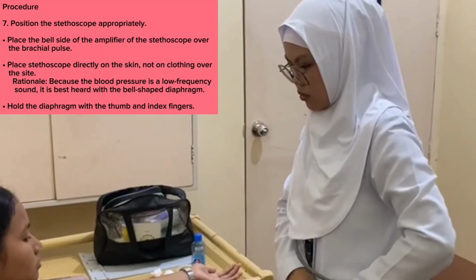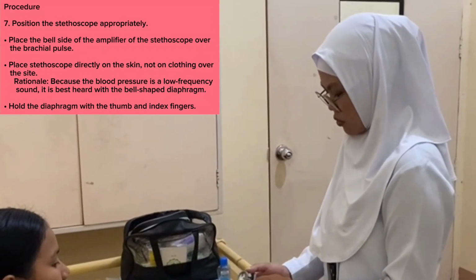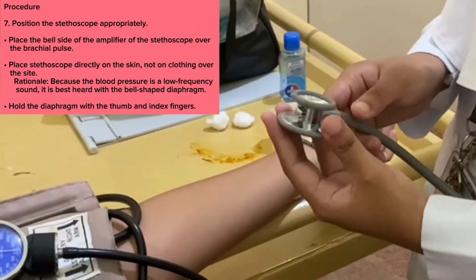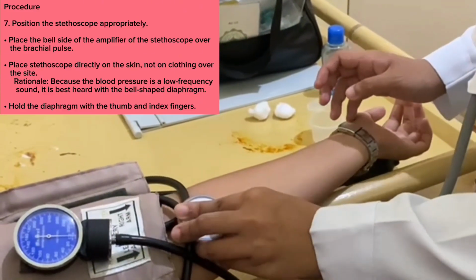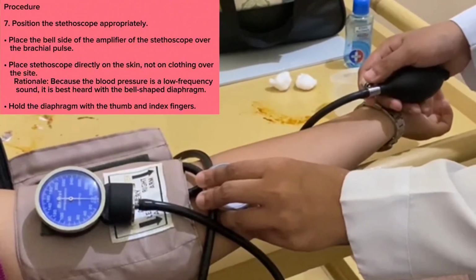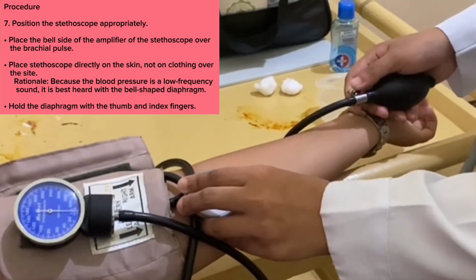Place the bell side of the amplifier of the stethoscope over the brachial pulse. Place the stethoscope directly on the skin, not on clothing over the site. Rationale: because the blood pressure is a low-frequency sound, it is best heard with the bell-shaped diaphragm. Hold the diaphragm with the thumb and index fingers.